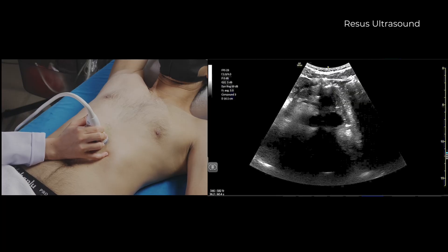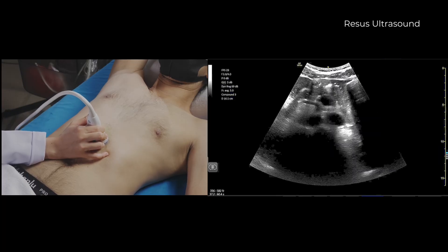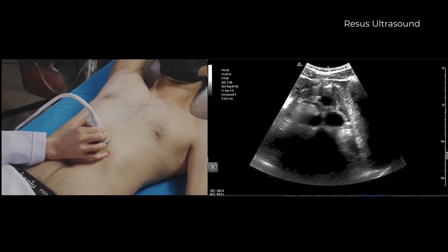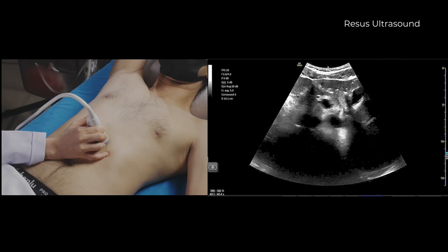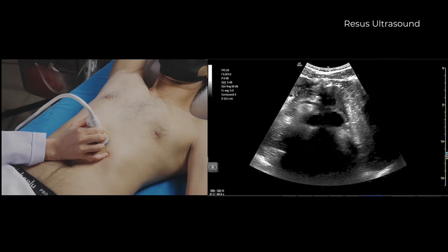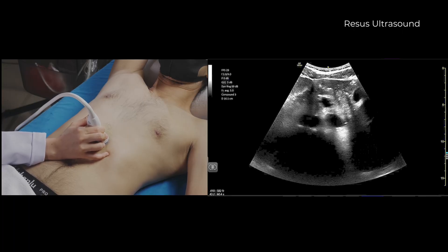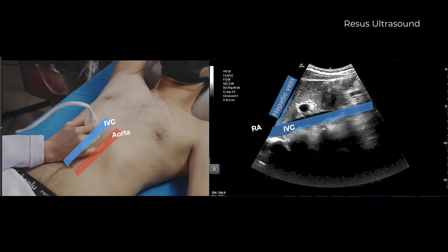We place the transducer 1 to 2 cm below the xiphoid process, with the transducer orientation marker set at 3 o'clock to measure the IVC in its short axis using the liver as a window. The IVC is on the right within the liver tissue, and the aorta is in the midline, being pulsatile and having a thickened wall.